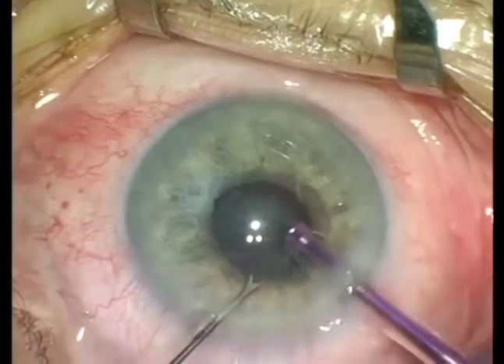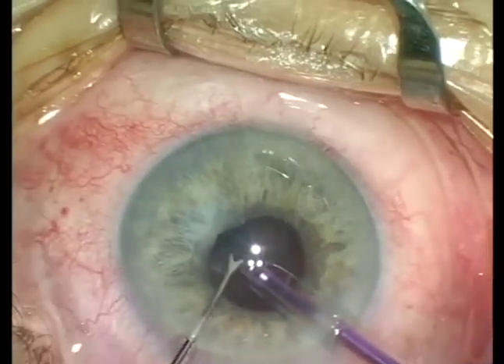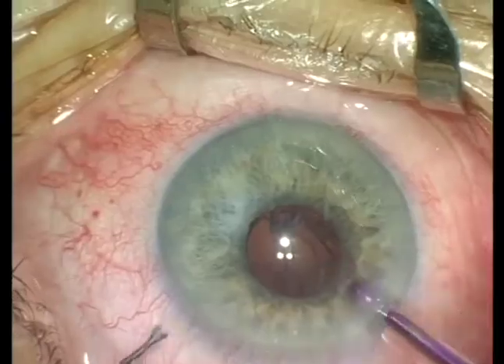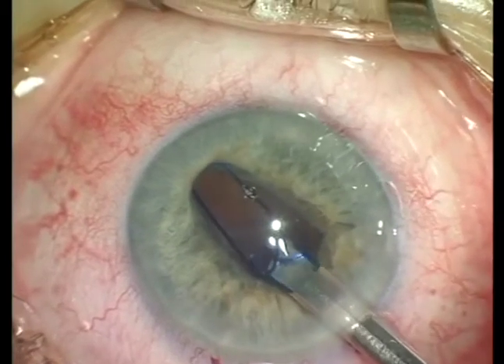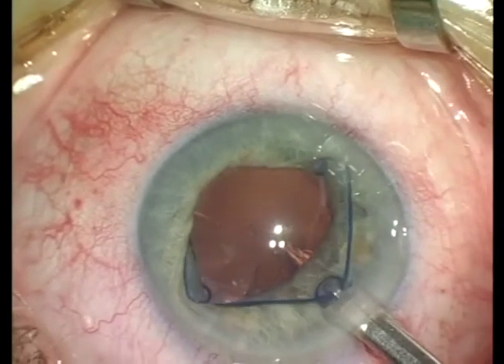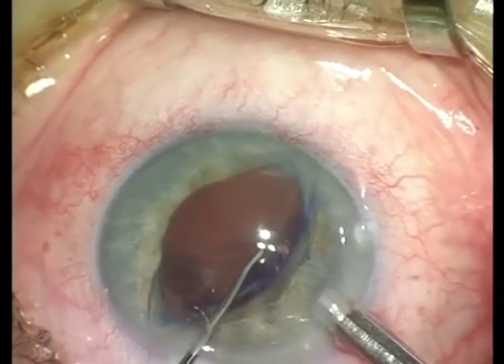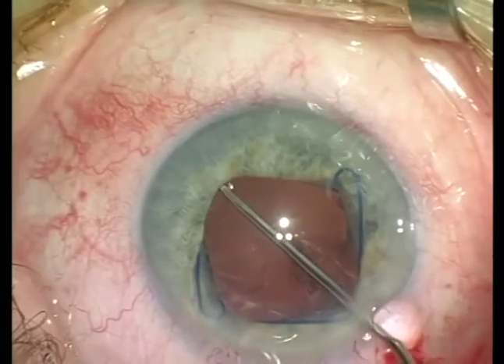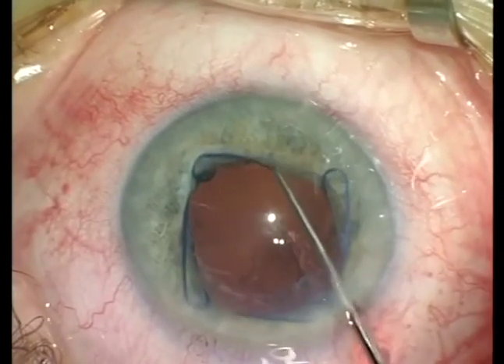The manipulations were done mostly at the very center of the anterior chamber to avoid catching the iris. However, sometimes it is possible, and you have to be quite careful not to damage the iris with ultrasound. At that point, the decision was made in favor of a pupil expansion device, and the Malugin ring is now injected into the anterior chamber. In these cases, specific care should be taken not to catch the edge of the anterior capsule, because the capsulotomy can be easily engaged with one of the scrolls of the device.